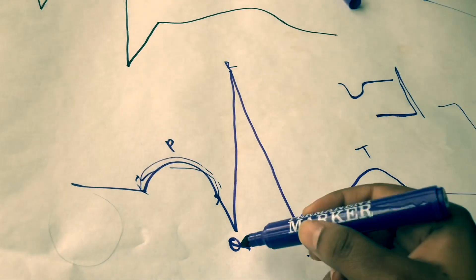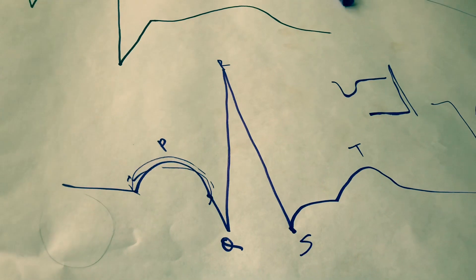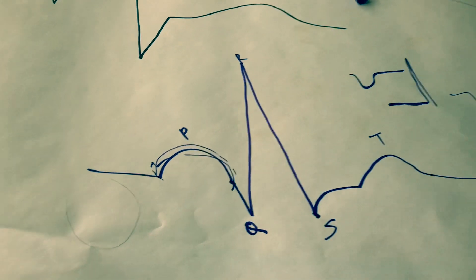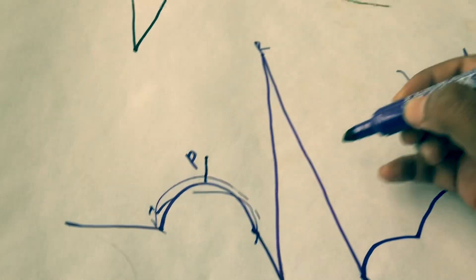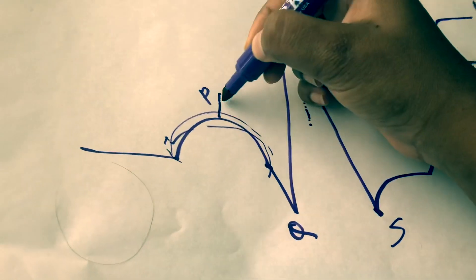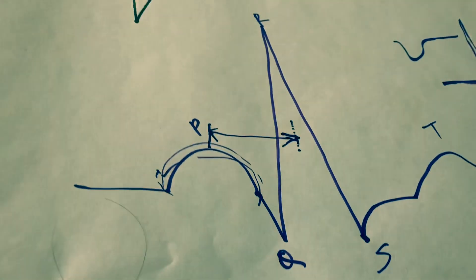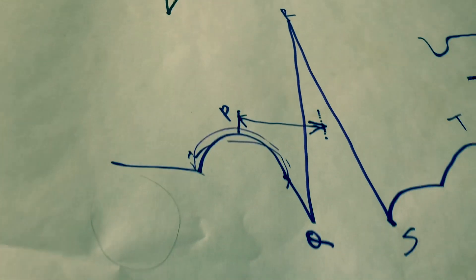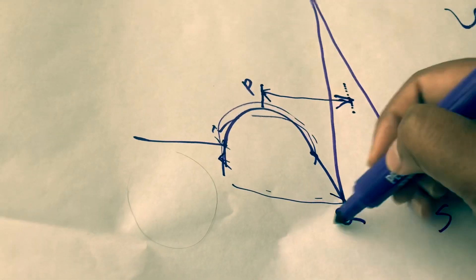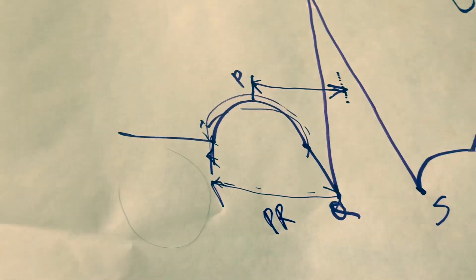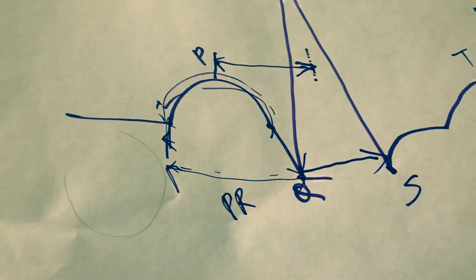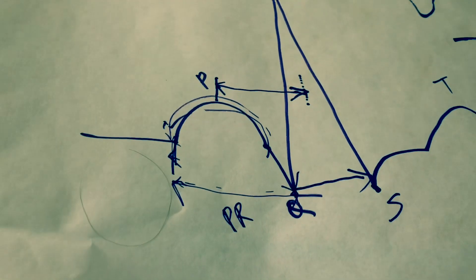The P waves are upright. That is why we need every QRS to be preceded by a P wave. We need to have all the P waves accounted for. Here we will measure the PR interval. The QRS is within the normal range for sinus rhythm.